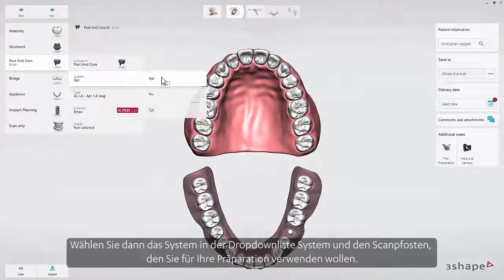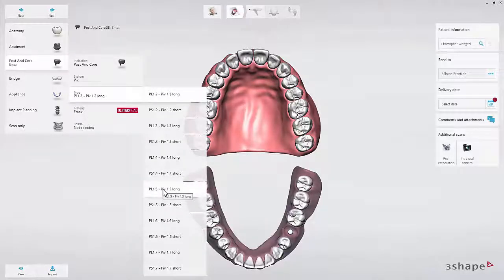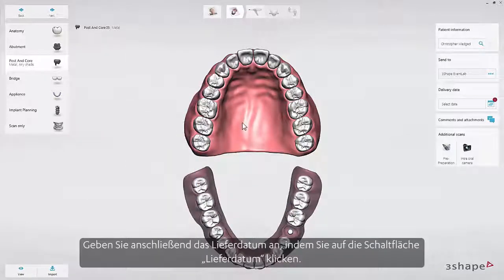Then select the system in the system drop-down list and the scan post that you will use for your preparation. At the end, select the desired material. Finally, set the delivery date by clicking the Delivery Date button.